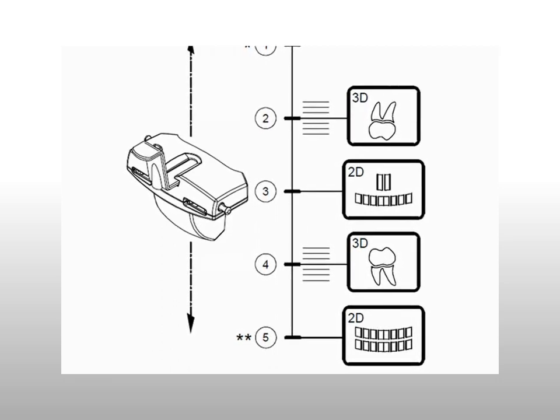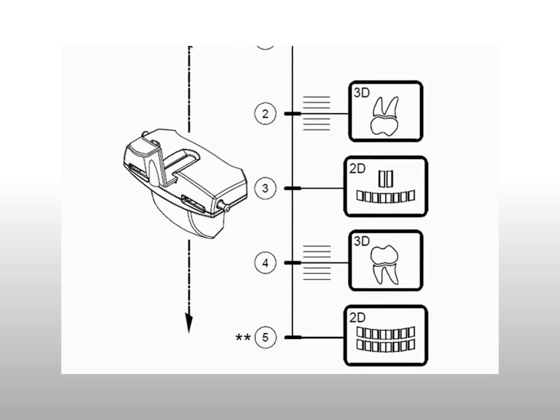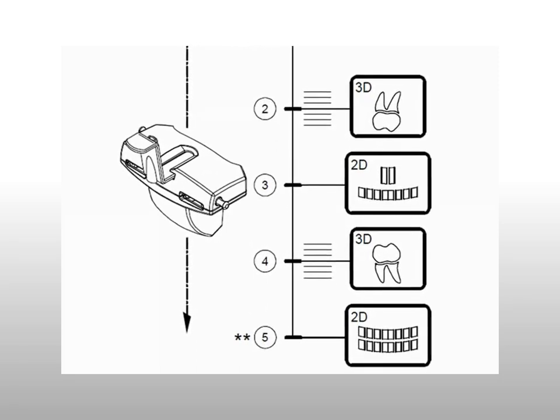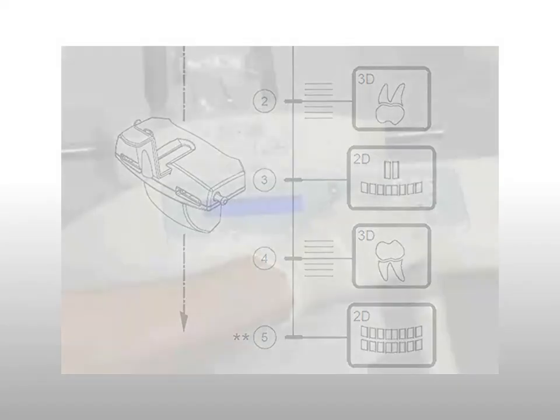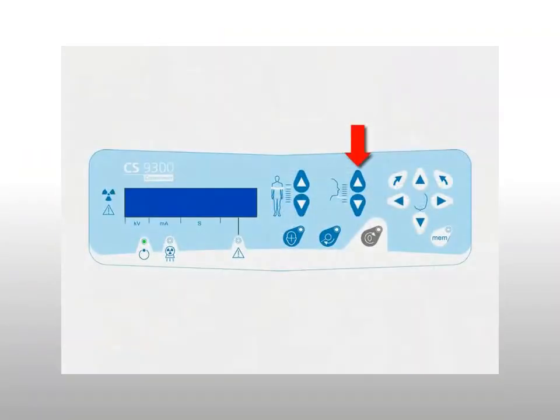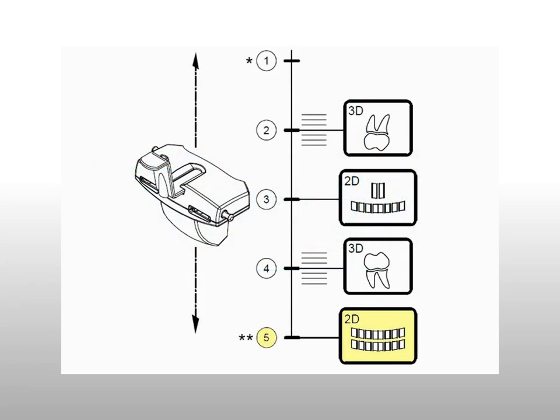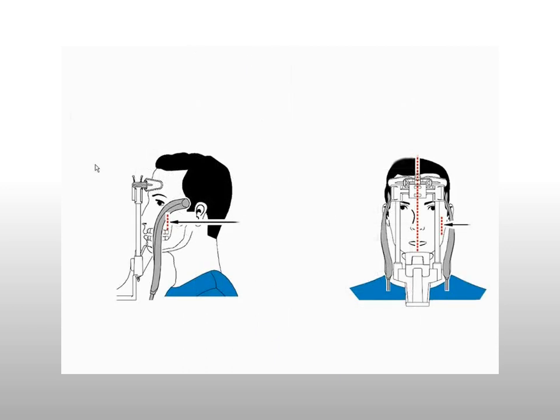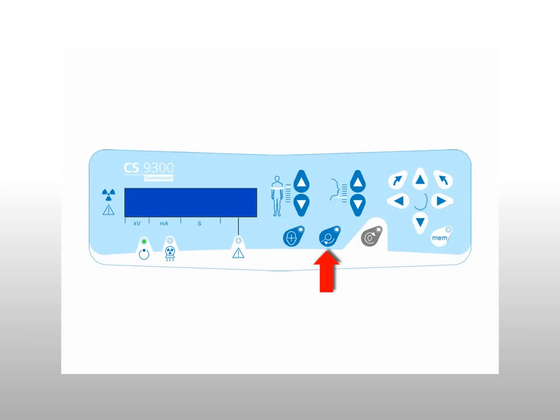The positioning indicators show the height that the chin rest base must be positioned before the patient enters the unit. For large field of view exams greater than 5x5, use the 3D head adjustment button to raise the chin rest to the highest position of the chin rest base — this is a beginning point and can be adjusted with the patient in the unit using the 3D field of view laser as a guide. Next, select the target button on the control panel to move the center of rotation to the area of interest for the scan.